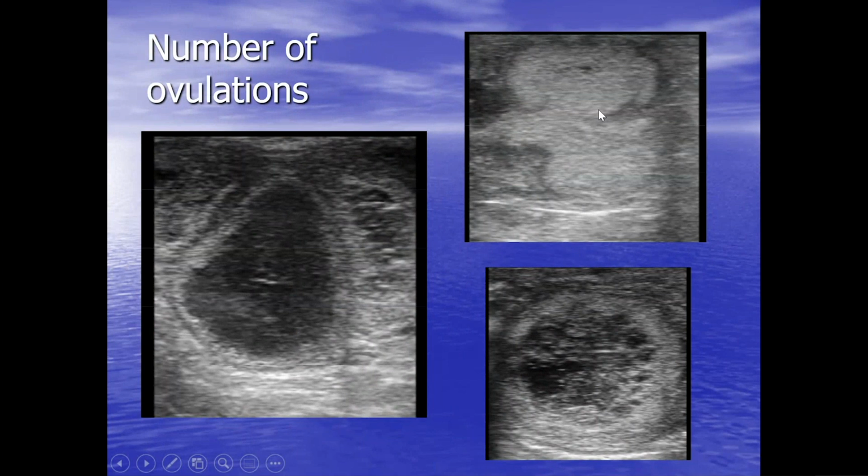This is 2 CLs. So the 1 there, and 1 up there. This is 3 CLs actually. 1 there, 1 there, and 1 there. So, like I said at the very beginning, important to get used to looking at number of CLs.